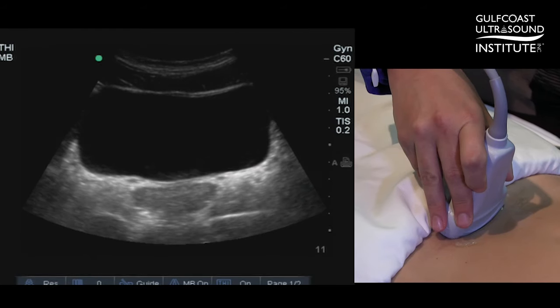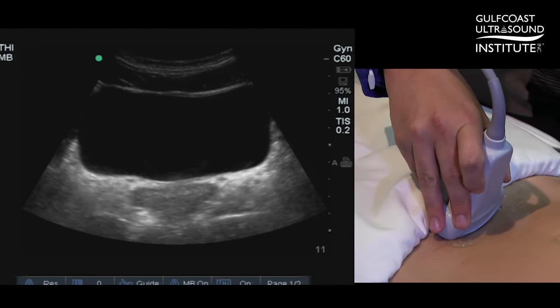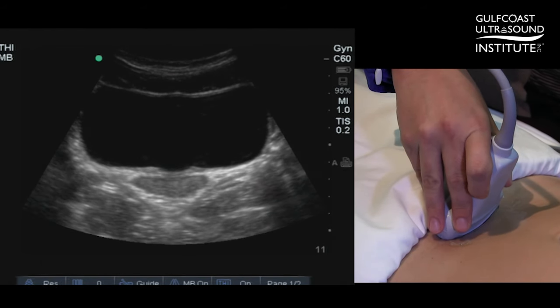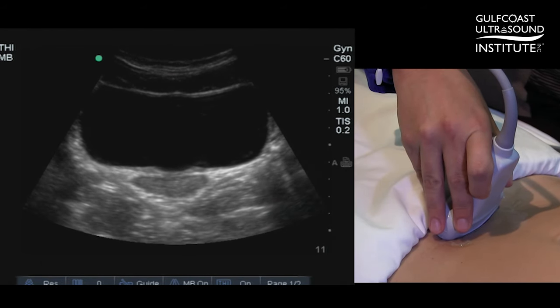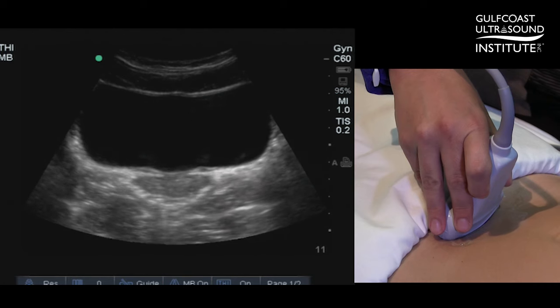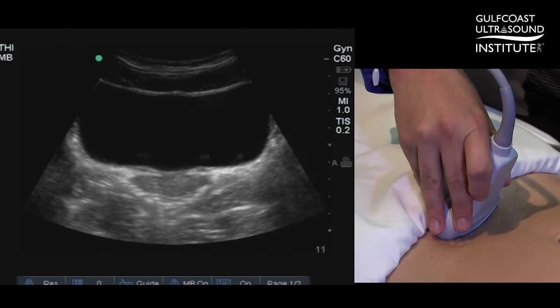Today's hot tip reminds you to always use the iliac vessels when searching for those elusive ovaries. Beginning in transverse, you want to angle inferior until you have a nice squared off bladder and then pivot the transducer's energy towards your side of interest.